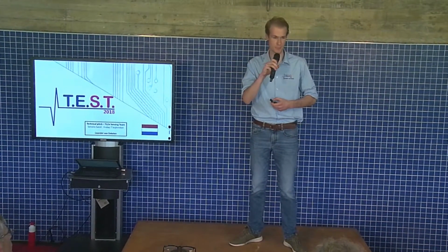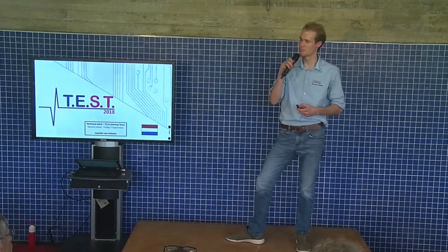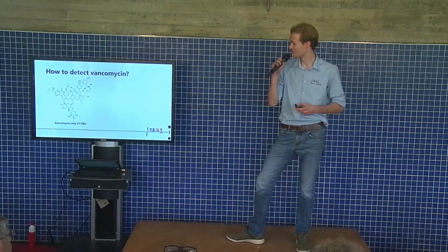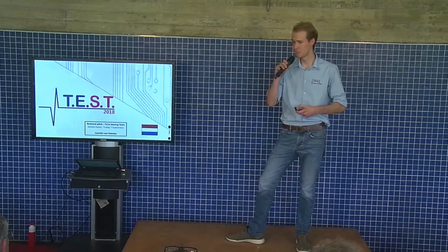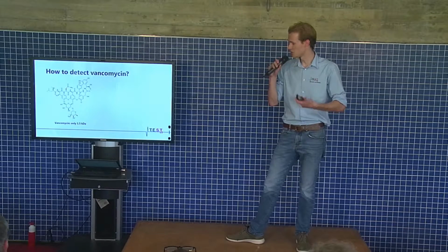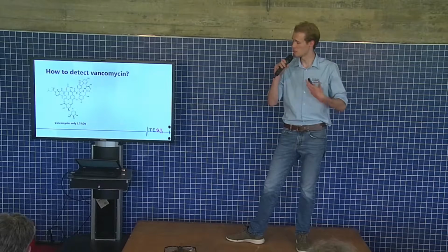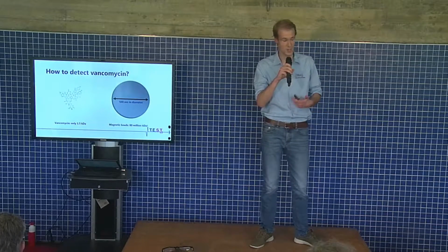And in this 3 minute presentation, I will tell you about the 9 months of development of our biosensor for free vancomycin. So the issue with free vancomycin is it's a very small molecule, only 1.5 kilodaltons, which means it is hard to detect on its own.